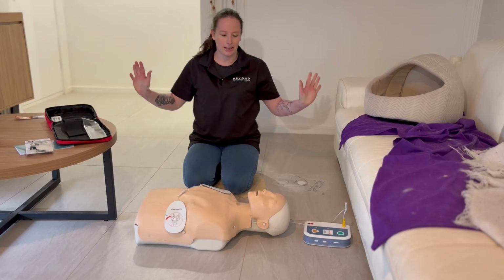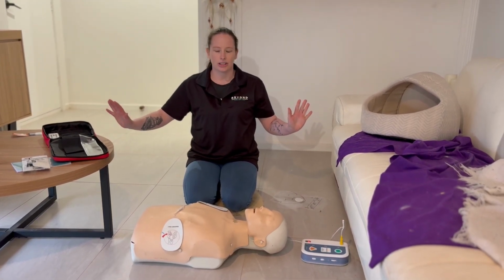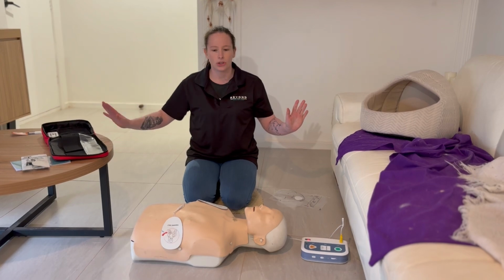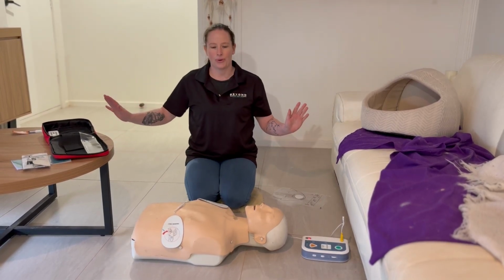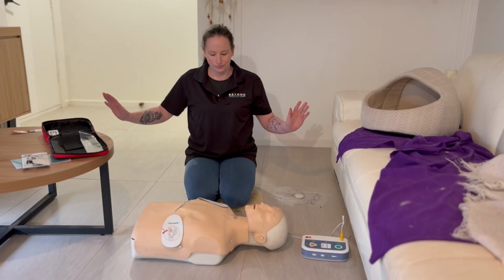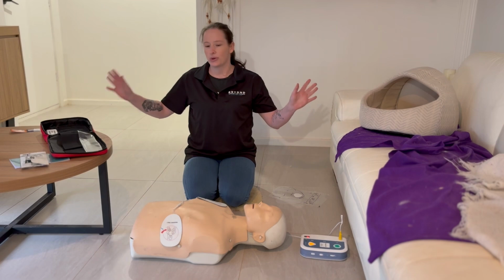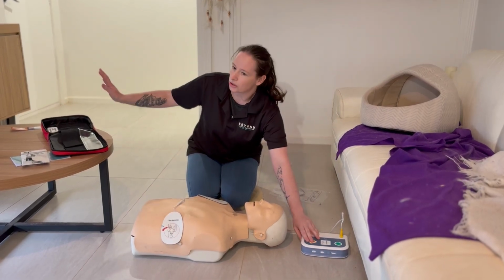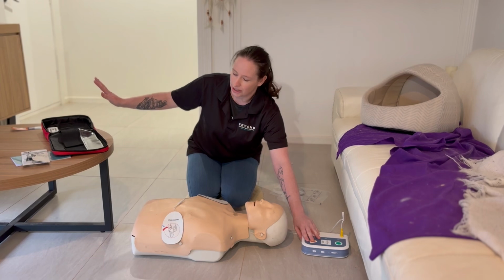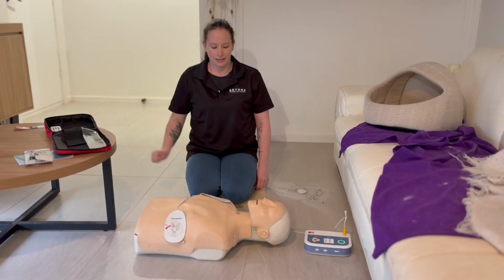Stand back, stand clear. Make sure your 360 is completely clear and no one else is touching. This is where you need to watch out for little children, parents or any other bystanders that may try and help. Stay clear of the patient. Having your hands up, make sure everyone is actually clear. When you're shocking, place your finger on the button, but always look down the body to make sure no one is touching. Then say shocking, shocking. Shock delivered.